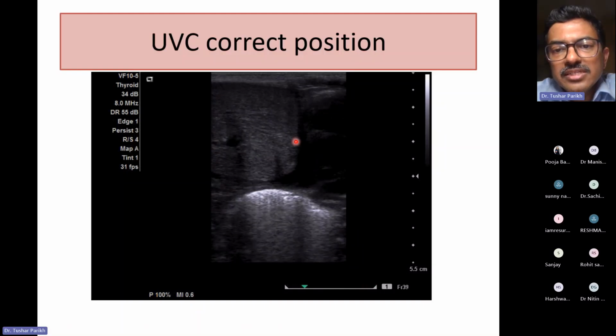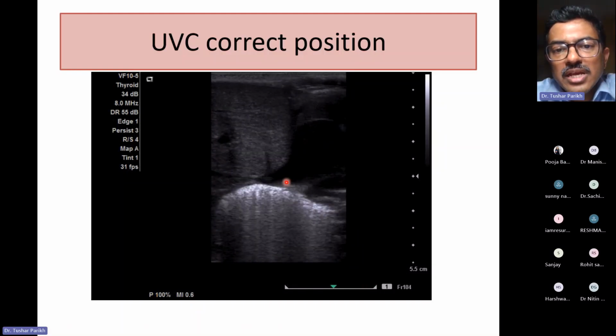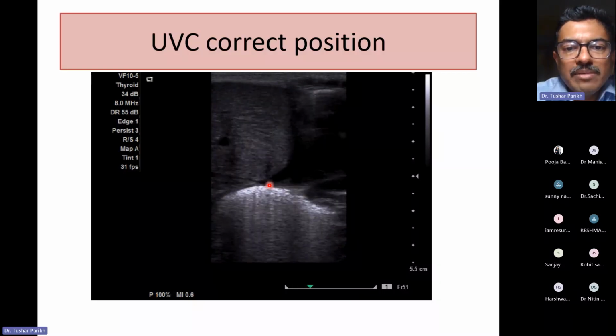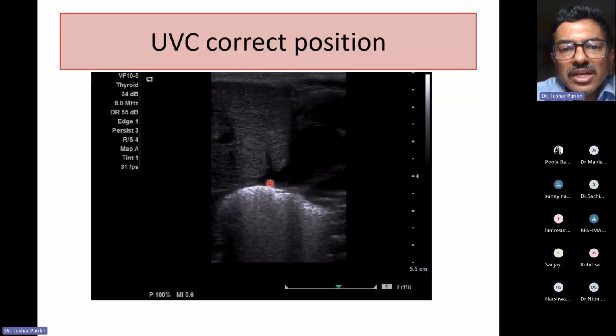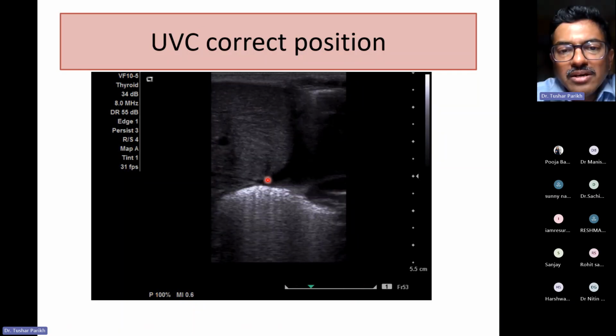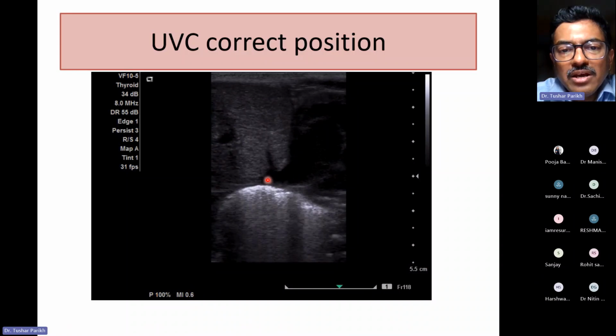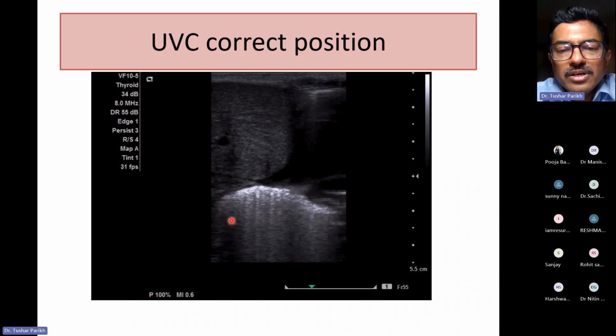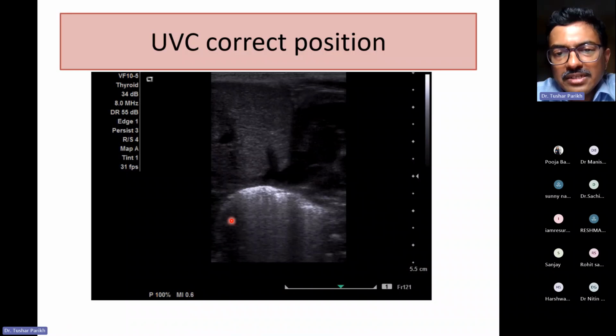This is the heart here. This is the RA, and this is the IVC, which is collapsing and opening. I don't know if you're able to see, but the tip is lying here. So the correct position is the RA-IVC junction. The tip is here, just below my pointer, and that is the correct position of the umbilical venous catheter. Okay.